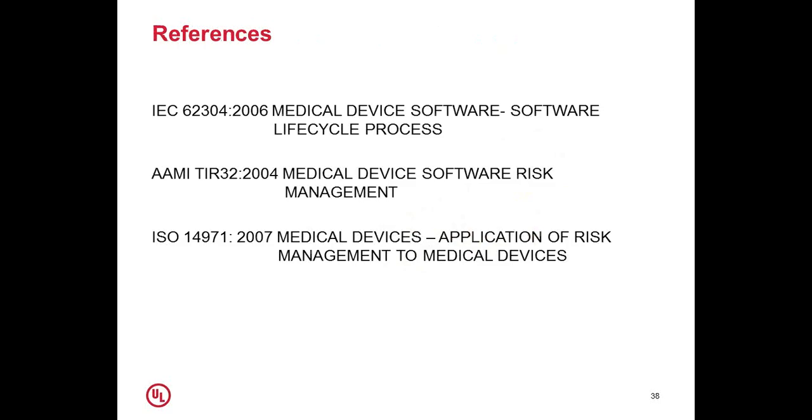I've used the following standards for your reference. IEC 62304:2006 is medical device software and software lifecycle processes, which basically discusses the process you need to follow for development of software, specifically medical device software. The AAMI TIR32 is medical device software risk management.